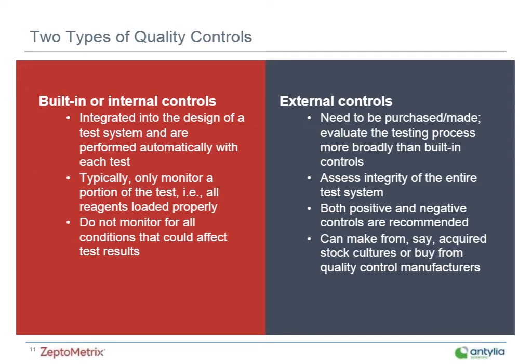And I think if we're talking in terms of quality control, sometimes internal quality controls and quality controls, those terms are used interchangeably depending on the situation. I know the WHO tends to use internal quality controls, or IQC, a little bit more broadly in their definition. But for the purposes of this presentation, when we talk about internal controls, we're speaking about built-in controls, or controls that are built into the system.